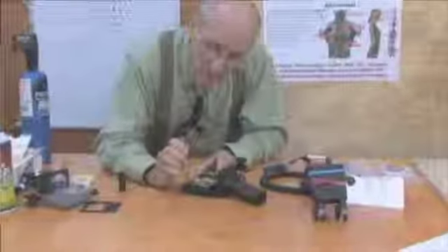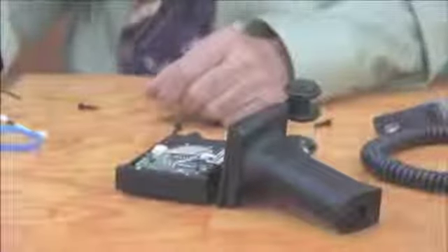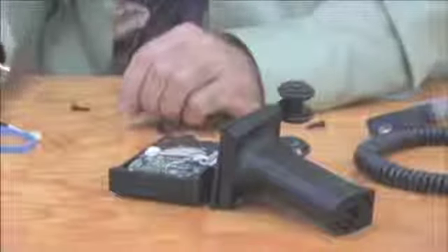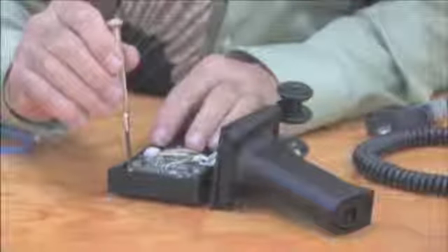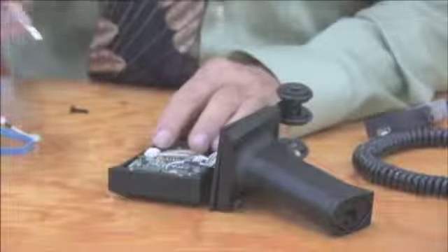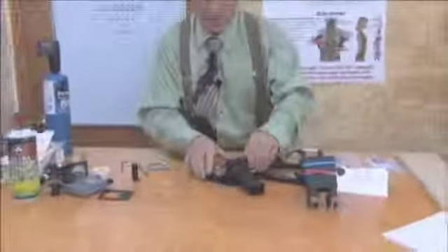Now that that's warm, I'm going to just burn a little indent into that screw. So I've created, in the sheared off flat plastic screw, a screw adapter. So now after it's cooled down, and I'll cool the screwdriver off with a sponge with some water, I can screw out the stud that's left. And then, so we do that to all 4. And all the threads are clear. We're ready to place the scanner back.